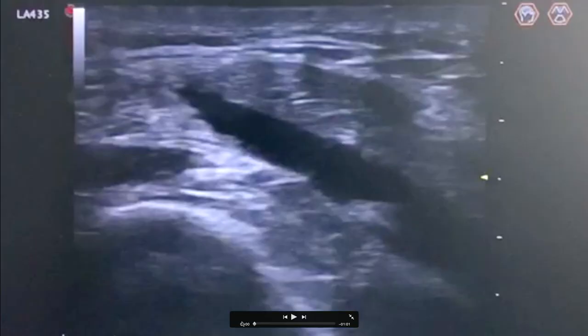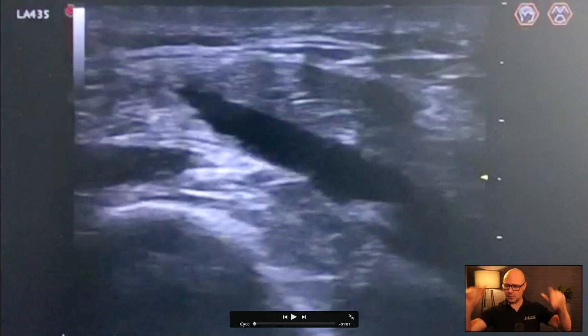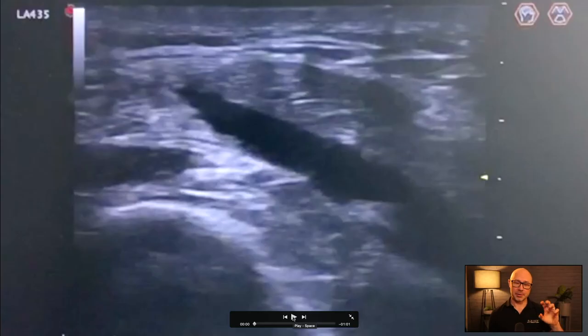So I'll just switch you over to the other screen — there we go — and we'll play the tape. You can see, just before we start, the dark area running through the middle of the video screen — that's fluid on my knee. We're looking to get the needle into that area in order to draw the fluid off.